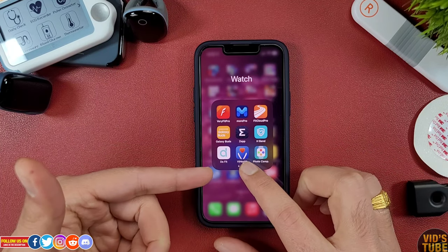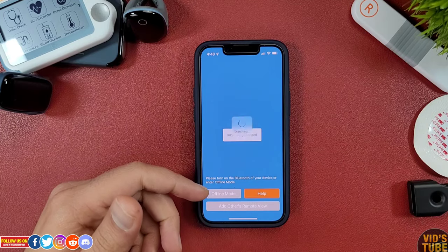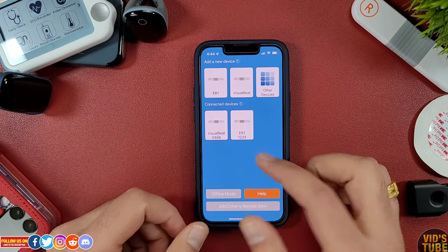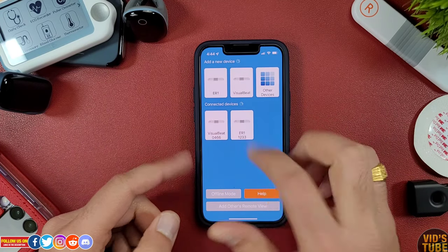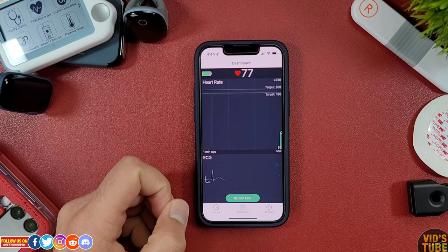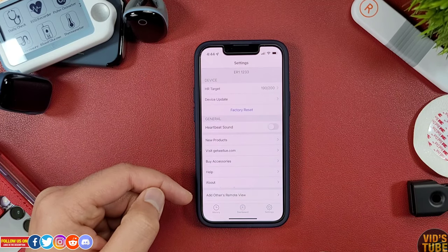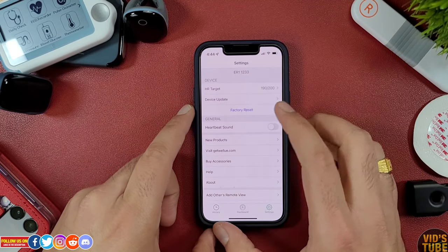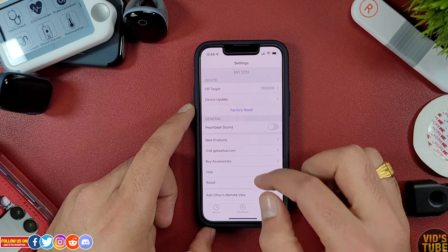The mobile vHealth app is available for free on both Apple App Store and Android Play Store. Once you have activated the AI ECG recorder as prompted on the app, you will be able to see the ER1 monitor in the connected device list. Click on it and you will instantly see real-time data under the dashboard tab. Under the setting tab, you can set the heart rate target zone, and other settings include device update, factory reset, heartbeat sound, and others.